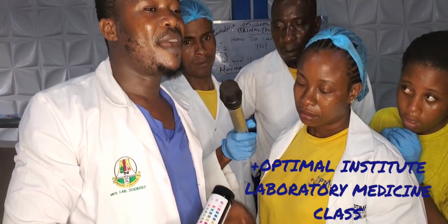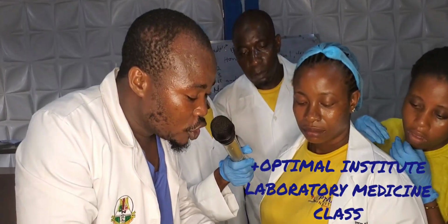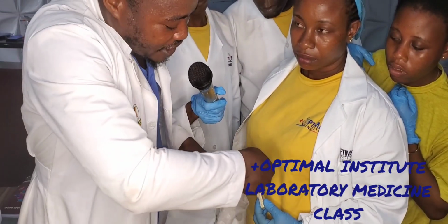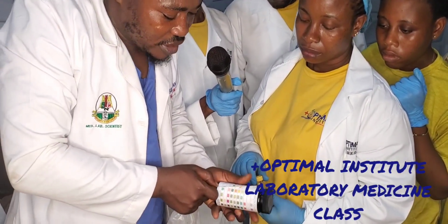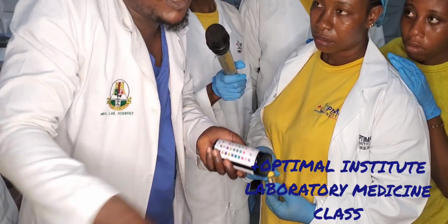Am I communicating? That is why you compare. If the first line matches when I put the strip inside the urine, it means negative. But if it matches the second till the back, it means positive. That is abnormal. We write it out like that.